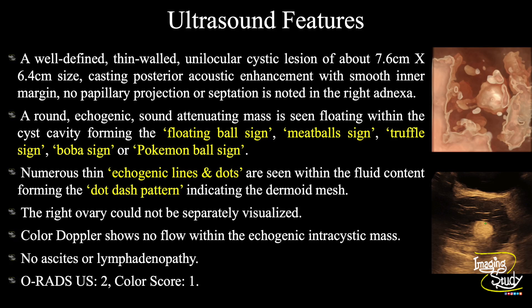There are numerous thin echogenic lines and dots within the fluid content forming the dot-dash pattern, indicating the dermoid mesh. We couldn't see the right ovaries separately; moreover, the patient is in a postmenopausal state. If you want to see the ovary, transvaginal ultrasound may give you better views. On color Doppler there was no internal or any abnormal peripheral vascularity. There was no ascites or lymphadenopathy. These features conclude it as a case of right adnexal mature cystic teratoma or dermoid cyst.